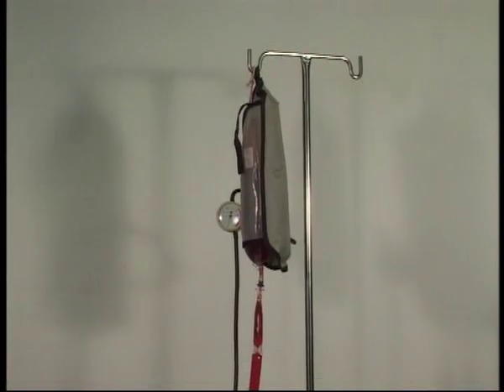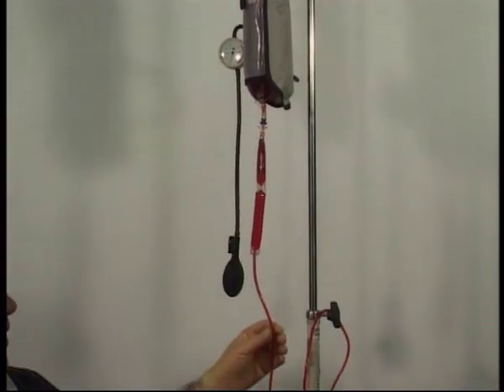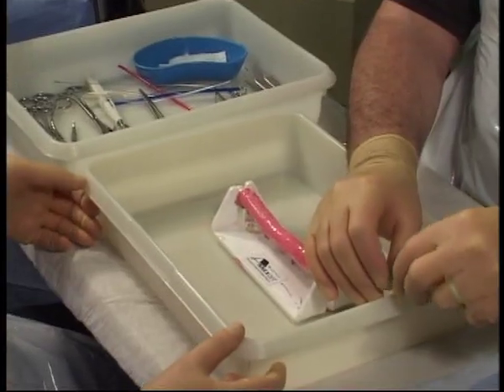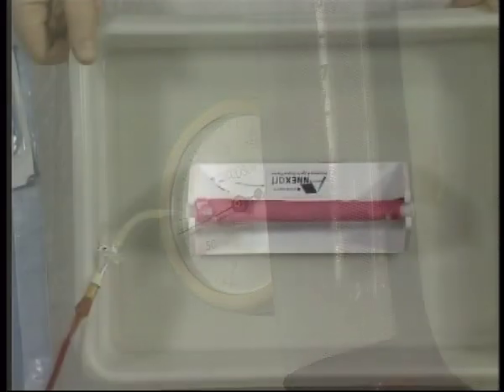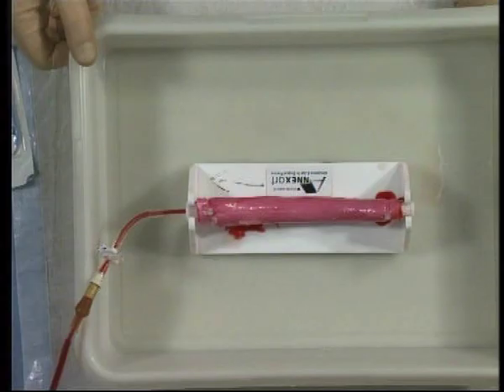A bag of artificial blood is placed in a pressure bag. The tubing is connected and the aorta is filled with blood, which is pressurised to 80 millimetres of mercury. Some leakage from the pig's aorta is to be expected.